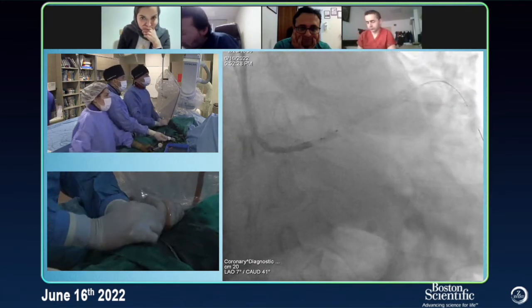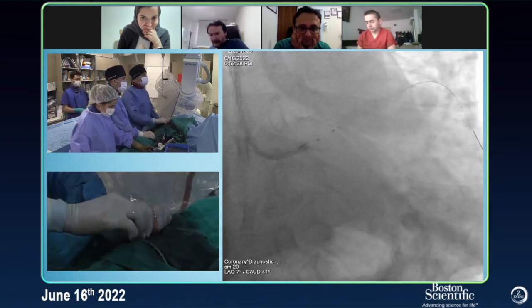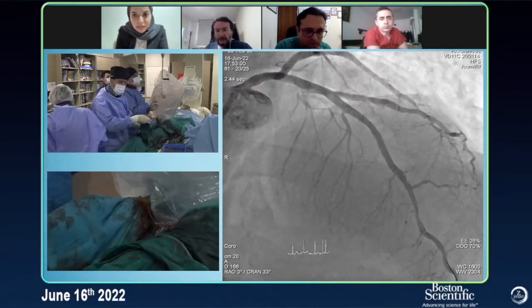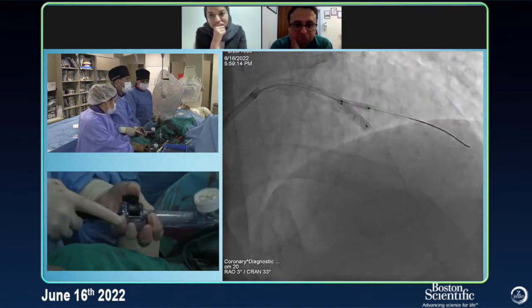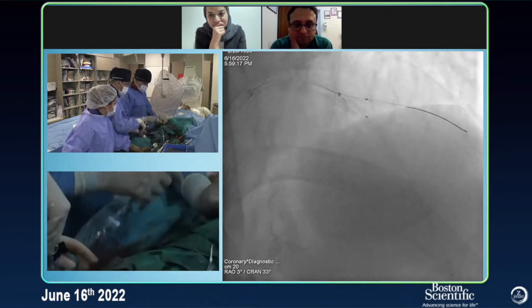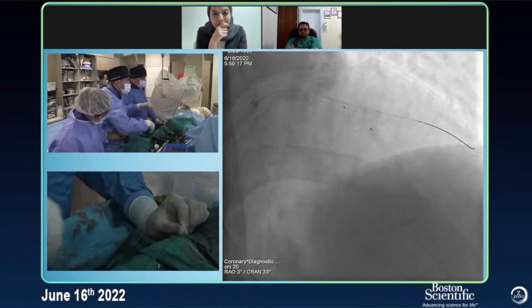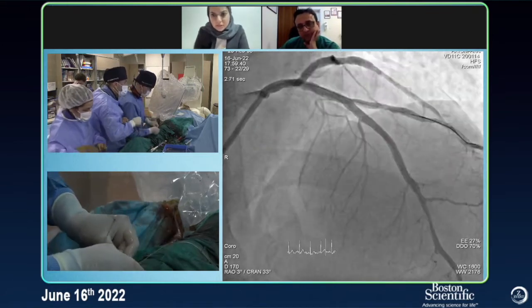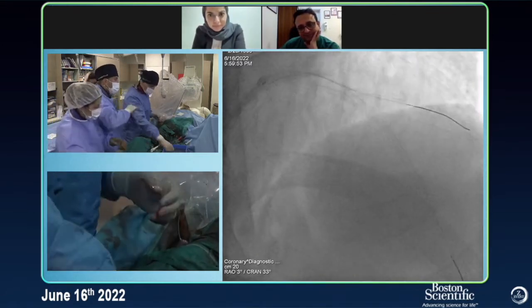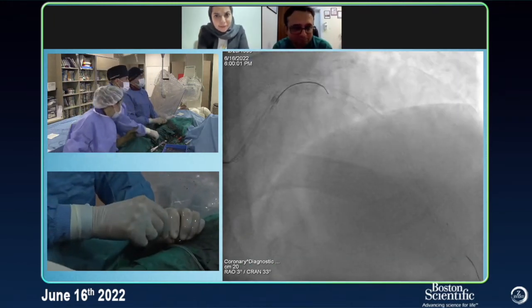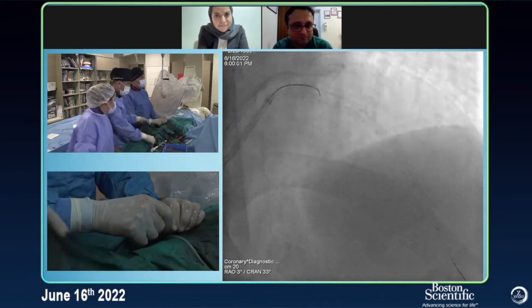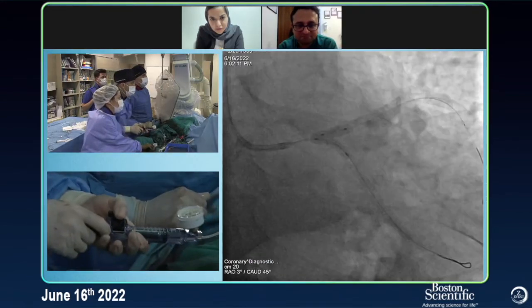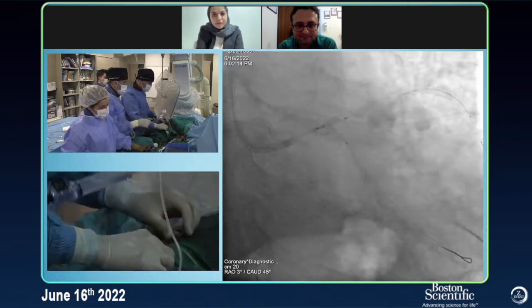At the end I'll recross and do kissing for sure. But let's focus on crossing the diagonal, do kissing, and then do POT all the way. Do 2.75 for the diagonal. Done. Let's see what we have here. I will do 4.0 for the proximal part. We actually break everything. 4.0 for the proximal and I'll go with the circumflex — spider view. 4.0, 3.5. Nice kissing.